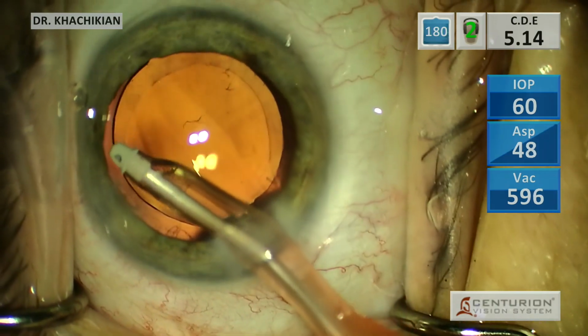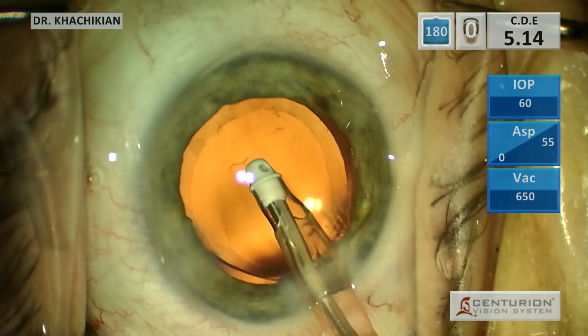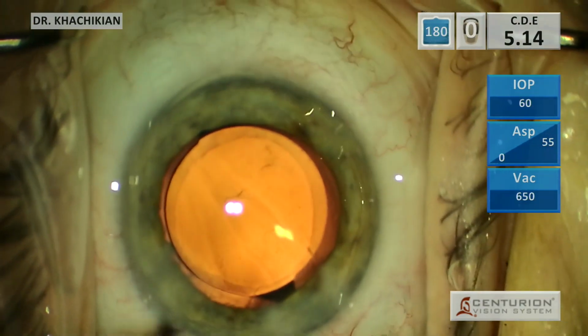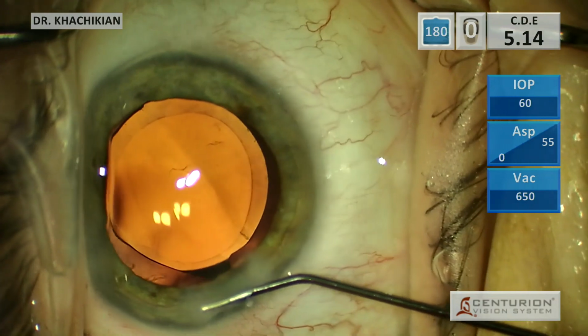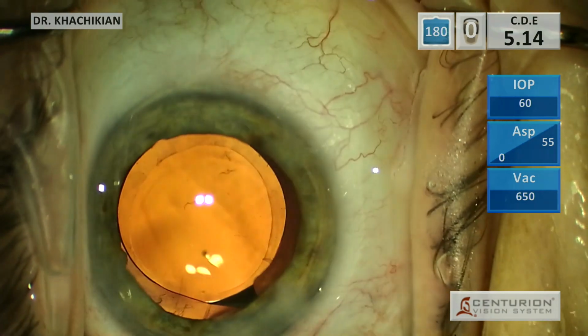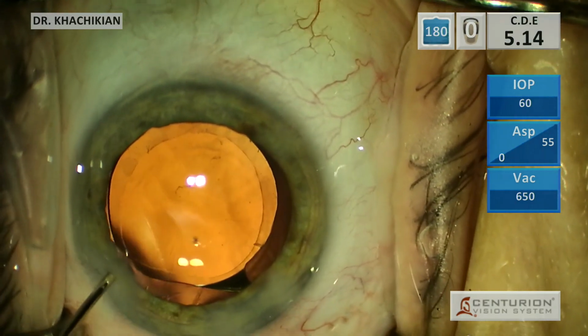There's maybe a little bit of cortex adhered to the posterior capsule. I'm probably going to leave that because you can always do YAG, but I don't really want any more trauma to that capsular bag. That's it. We'll seal up the incisions, but I wanted to show you how, even though it just looked like I was pulling on some remaining cortex, it was tugging the whole capsule.